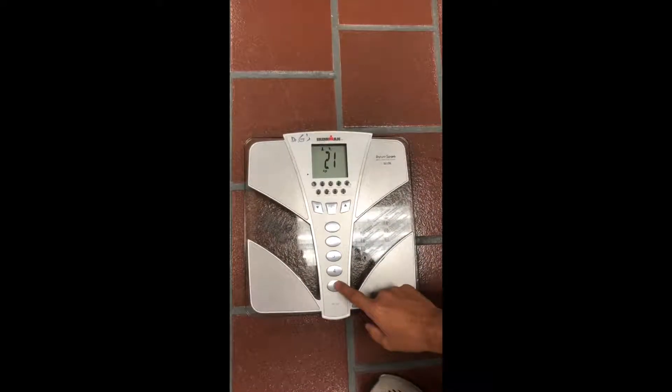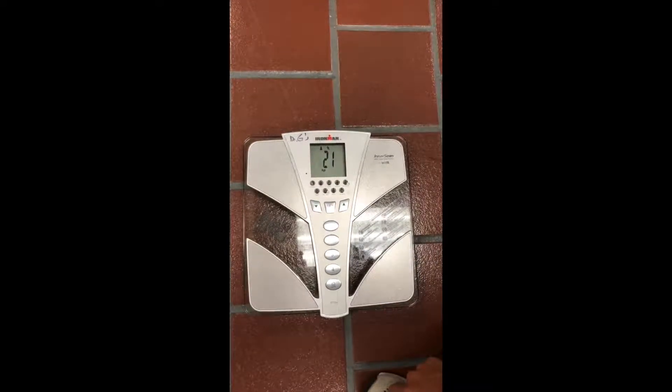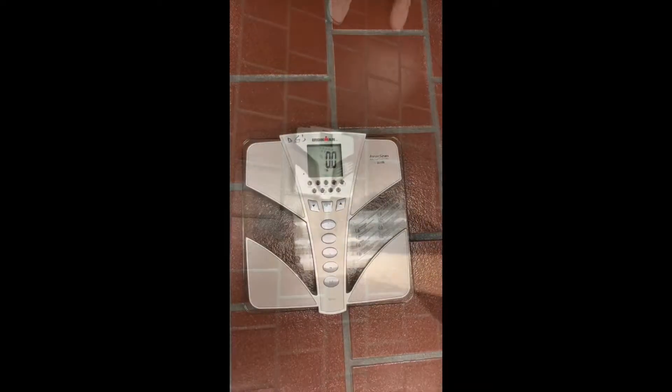Once set, turn off the monitor and then turn it back on to recompute. Ask the patient to step on the scale and allow for measurement readings to be taken. It should only take about 30 seconds.